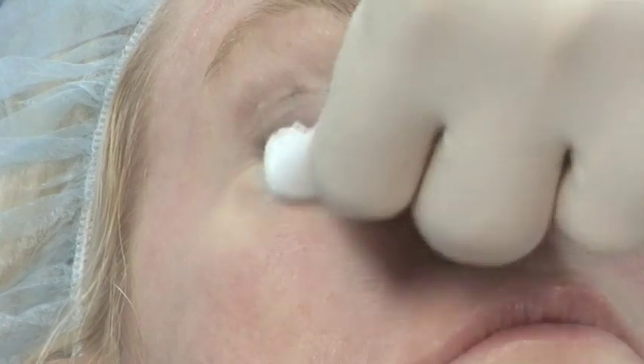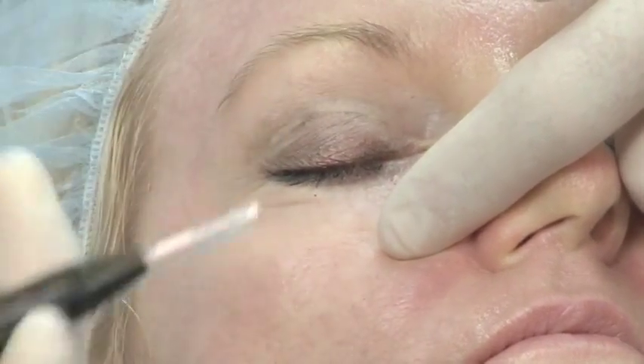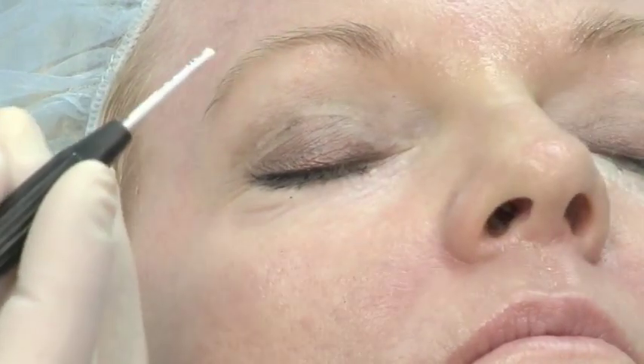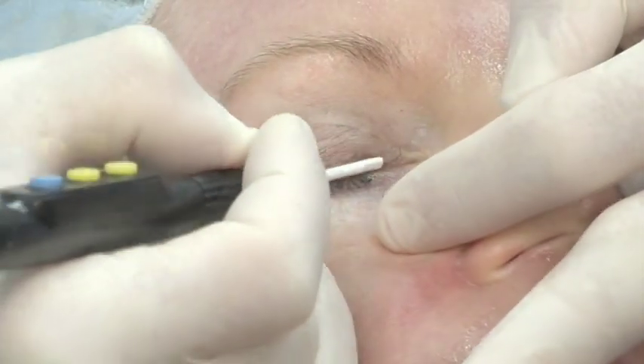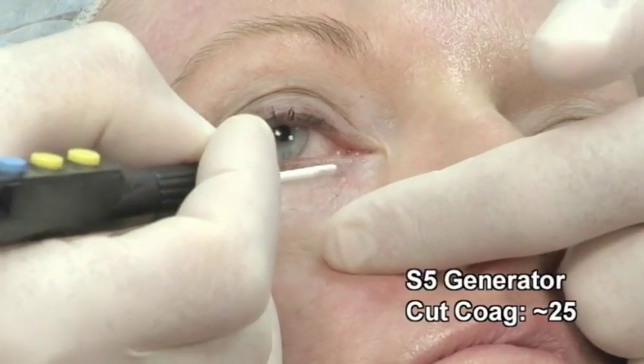We've prepped her — she's had some local injected. We put some ice on the area to decrease the swelling, and we put some tetra-K in her eyes. We use a little smaller loop in this case. It's very important to stabilize your hands when doing this. I'm going to start out with a setting on the S5 of 25 on the coag and cutting mode, and we'll see if it's too much — I can adjust if necessary. Open your eyes just a little bit; you don't want the eyelashes to get in the way, and that's where the tetra-K also helps.